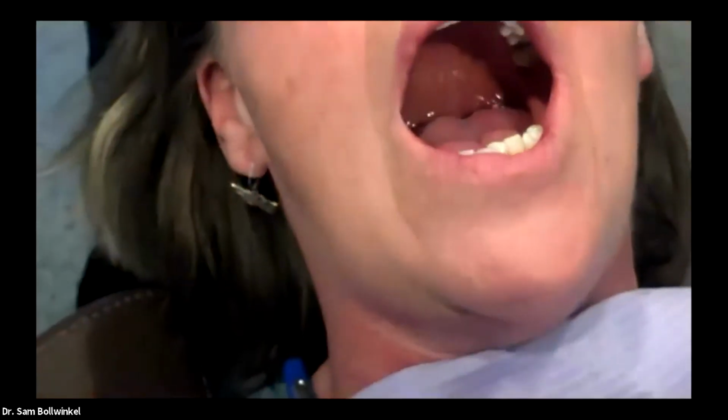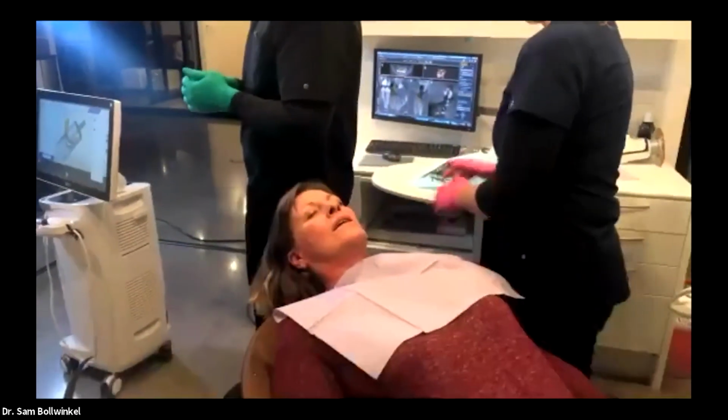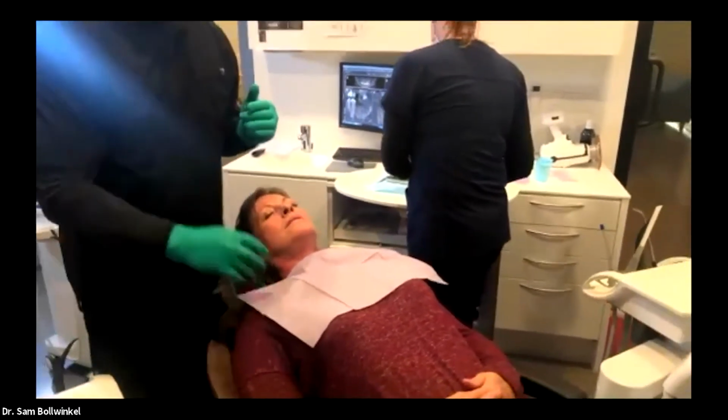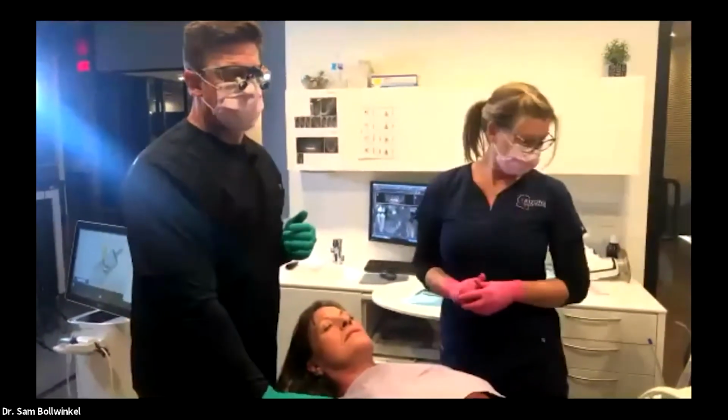Let's do this. That's our implant placement with a little bit of narrative and a little bit of information. What is our time? 8 minutes? 7 minutes, 57 seconds. It didn't go down all the way the first time. We backed it a little bit, gave it a little bit more torque. Torqued at 45, which is fantastic.